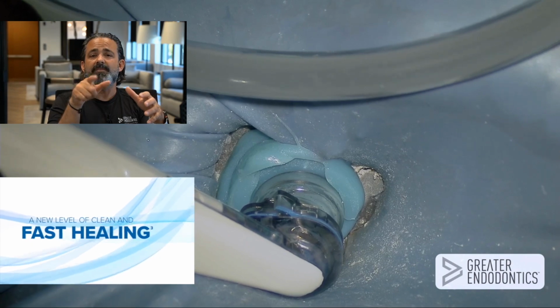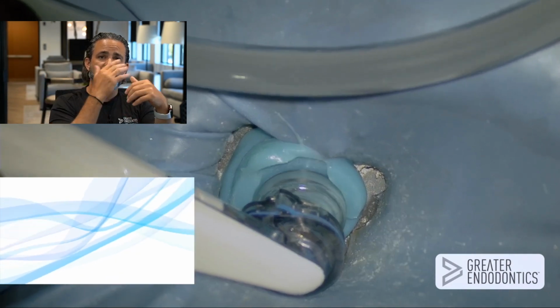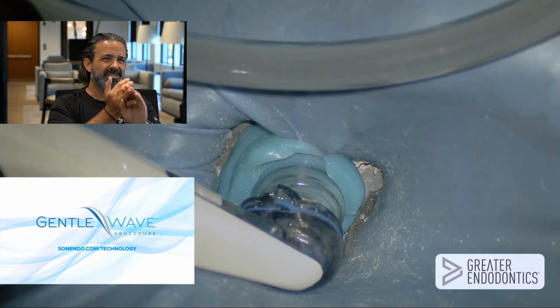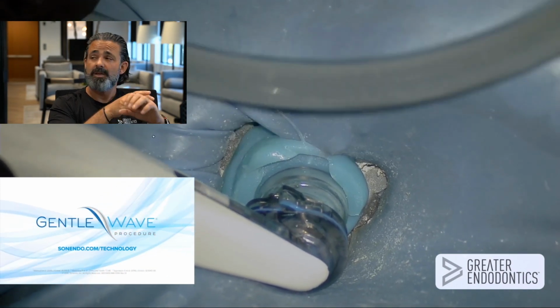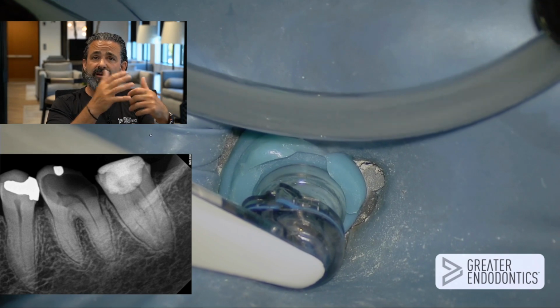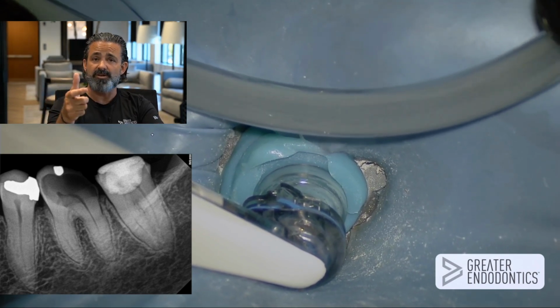And that's what that animation is trying to describe to you, as it's sort of spiraling down the root with an echo of a sound wave along with it. So you have movement of fluid dynamics. You have a slight increase of temperature change, which is also a catalyst for the chemical. And then you have the sound wave, which is another catalyst. So you have agitation, you have heat as catalyst for the chemical activation of sodium hypochlorite. So you get an accelerant going on.